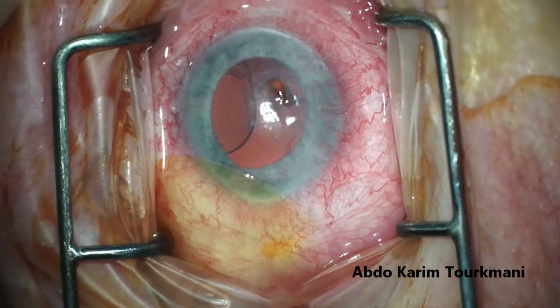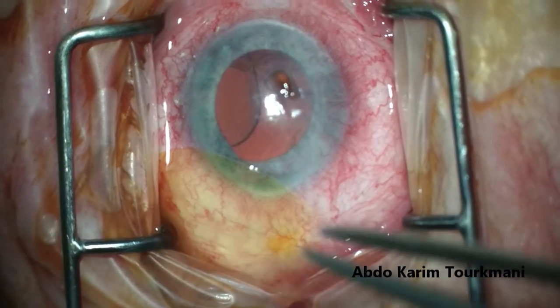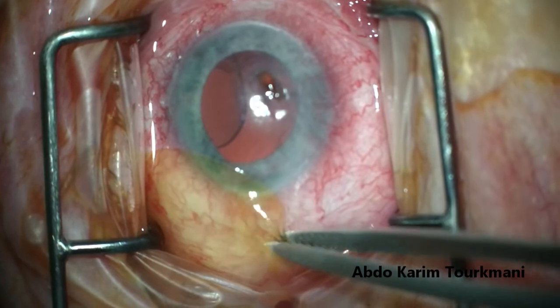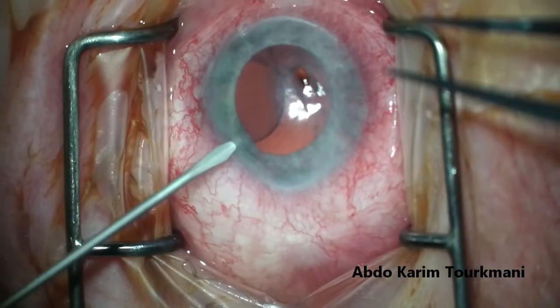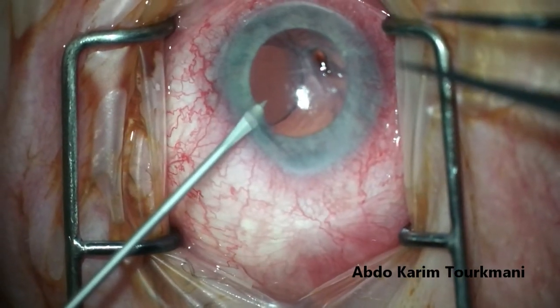Hello, this is Dr. Turkmani, and this is an interesting case of anterior segment reconstruction. Patient that presents to casualty with corneal perforation of unknown cause, presumably herpetic, and a subluxation of the lens. It is unclear whether there is a torn posterior capsule with vitreous prolapsing in the anterior chamber.